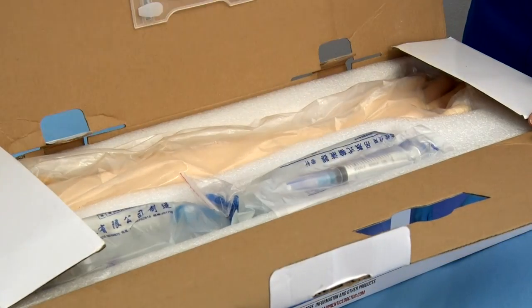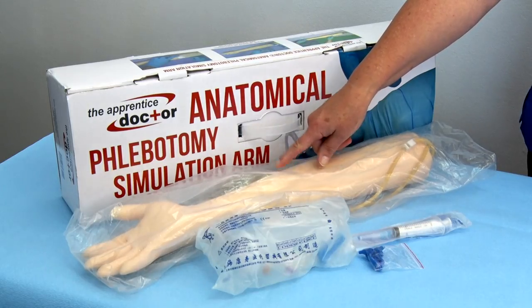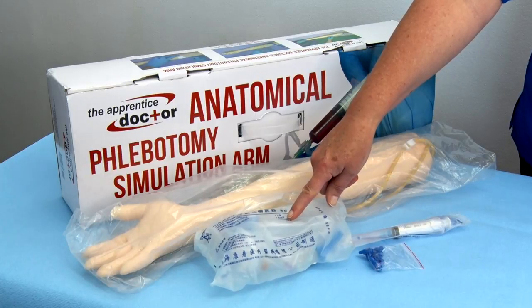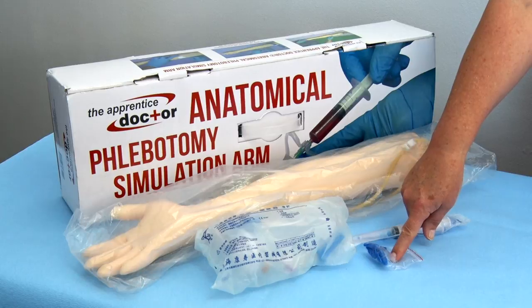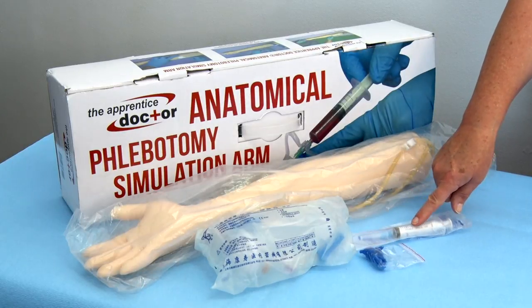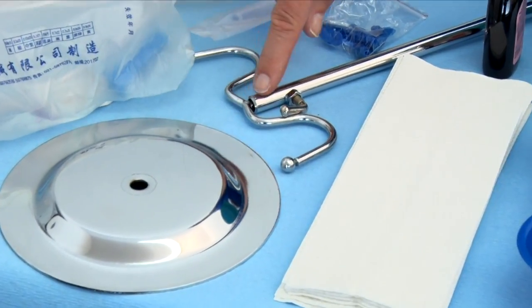Open and unpack the following items: the Phlebotomy Simulation Training Arm, one of the two reservoir containers with tubes attached, a small packet of connectors also used as lumen stoppers, a syringe with needle and/or scalp needle, and the various metal parts used to assemble the stand.